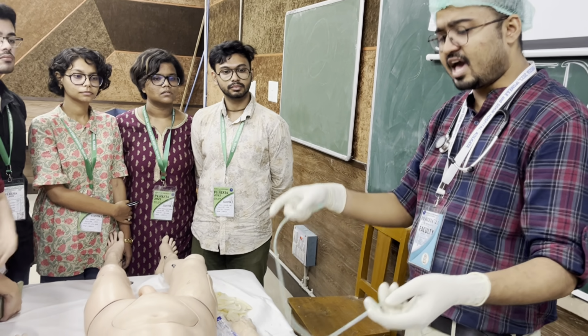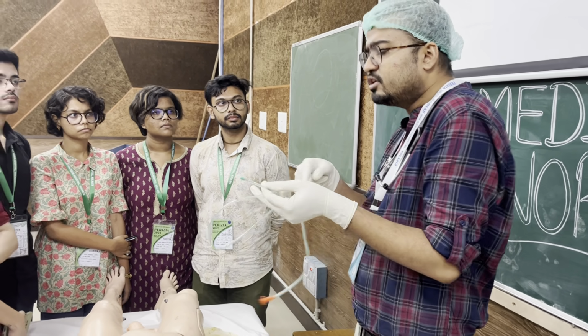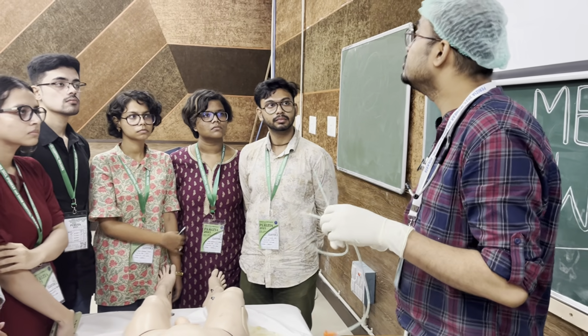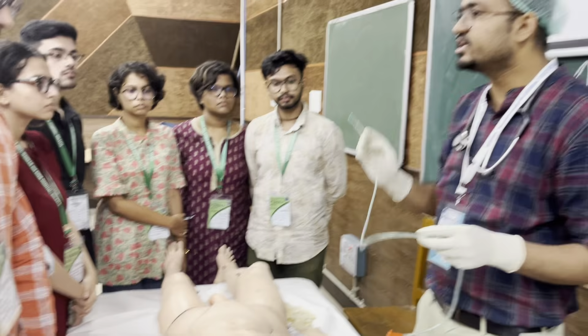So second mark. And as the height differs from person to person, it is ideal not to go by this marking, you should measure instead. That is the importance of measurement. So we have taken the measurement.